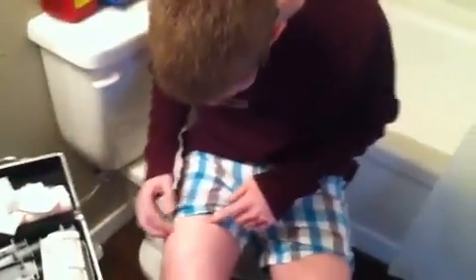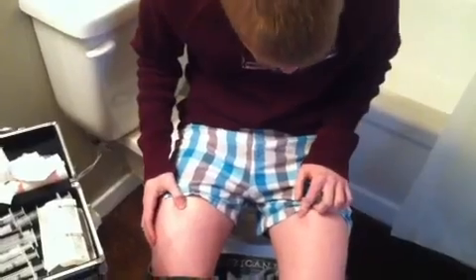Now it's time to pull your pants down. You gotta take your pants down, of course, and then you're gonna prepare whatever side. I tend to generally switch sides because I don't want track marks. There's where I injected last time. As you can see, I have a little bit of a bruise left over. I inject once a week. So you generally want to pick out a pretty good spot.